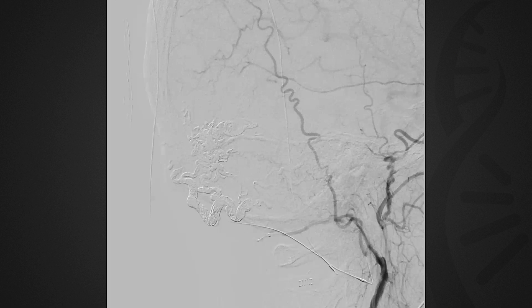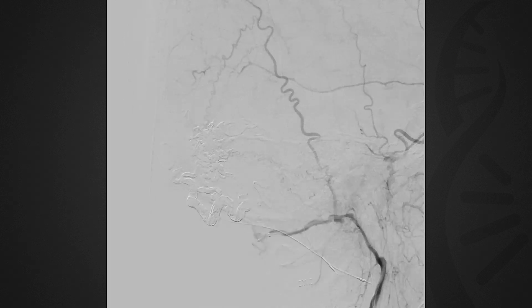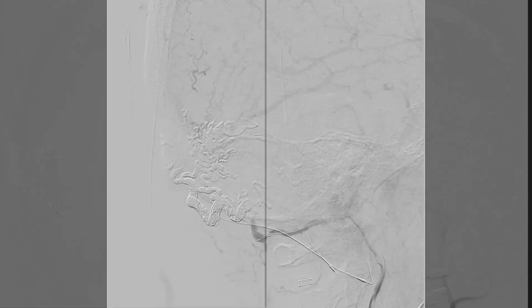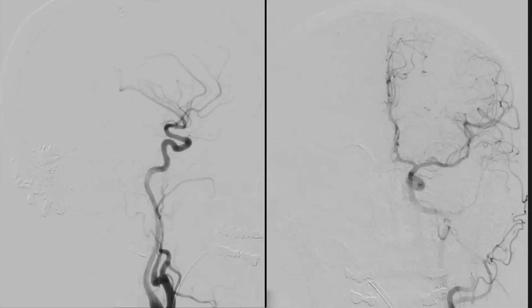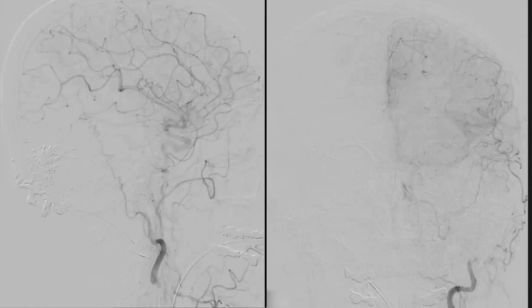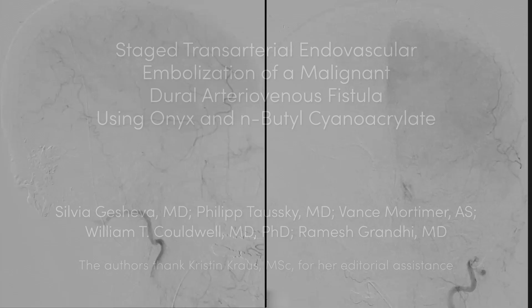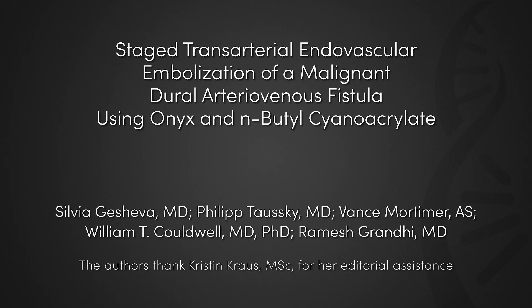A control angiography run following embolization with NBCA demonstrated complete obliteration of the complex malignant fistula with restoration of normal cortical venous drainage.